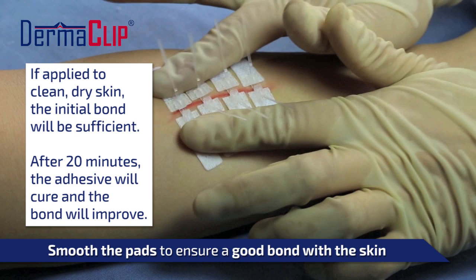While the initial bond is strong enough to close the wound, the device will continue to improve its bond with the skin during the first 20 minutes it's on the body. Advise the patient not to test or pick at the device during this time.